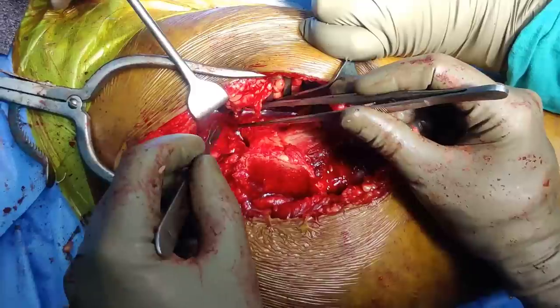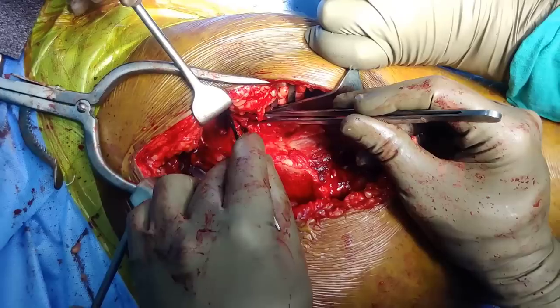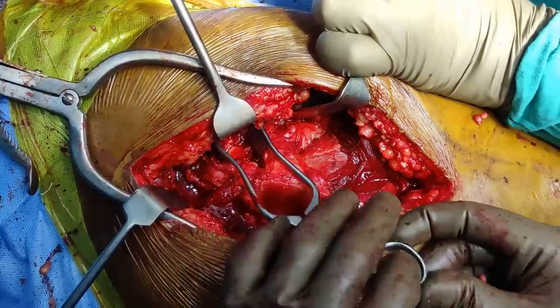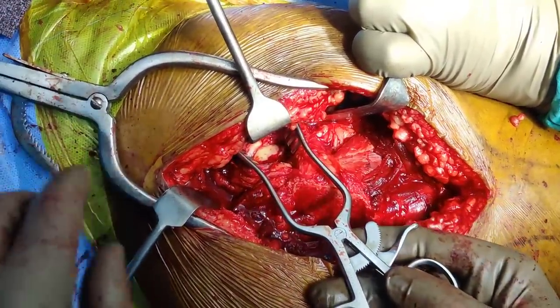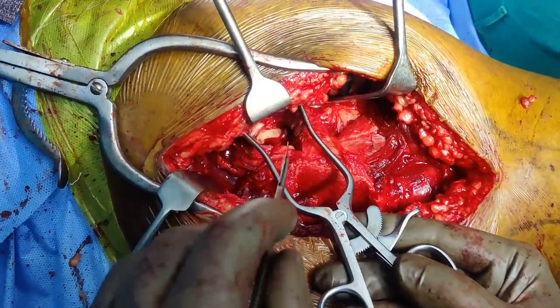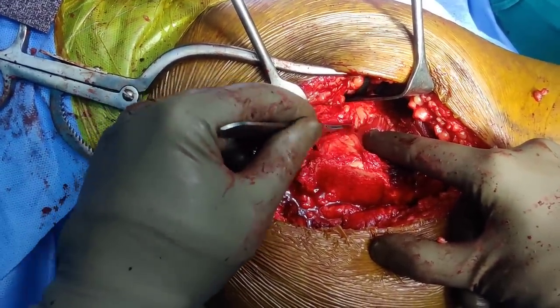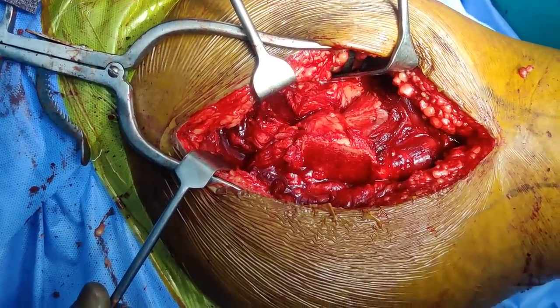If you are dissecting close to the acetabular margin, go very superficial and open it gently. Once I reposition the small self-retaining retractor you can start seeing the femoral head. When you are close on the superior aspect, stay away from the labrum. This is your first limb; the second limb is going in the inferior direction.